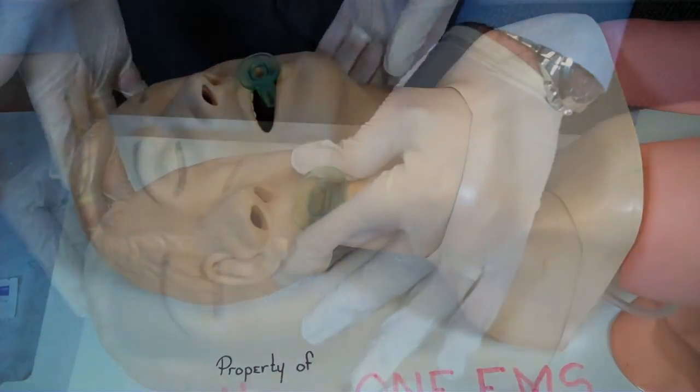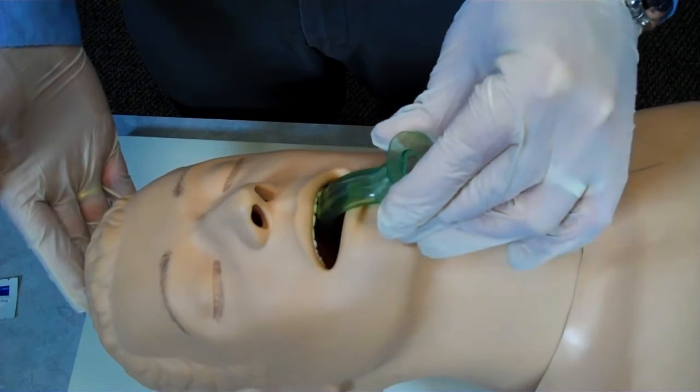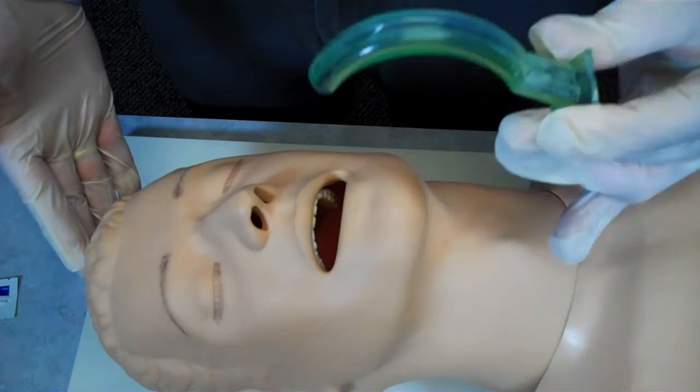If the patient begins to gag on the OPA, I remove it following the anatomy of the oropharynx and suction if needed.